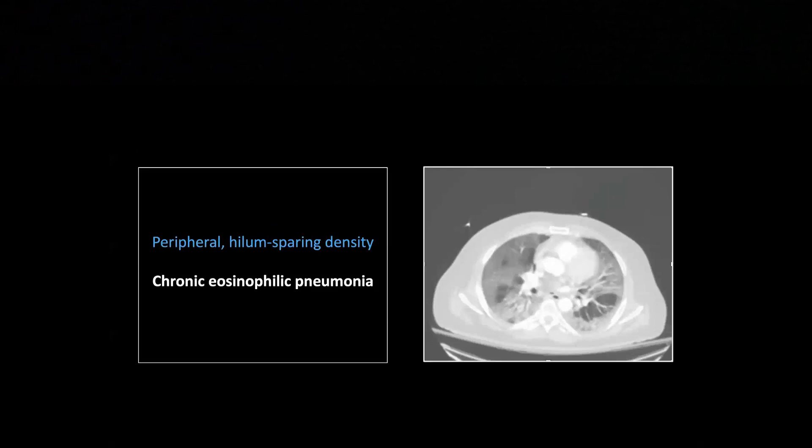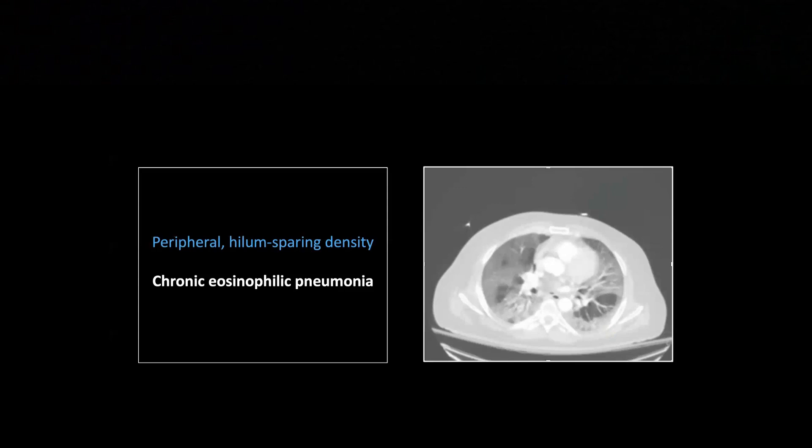A little less common. This one is what they call reverse pulmonary edema. It's the exact opposite of what we were just looking at. It's peripheral and it spares the central portions of the various lung lobes. This is unfortunately one that's also nonspecific. You look up reverse pulmonary edema and you'll get a whole big list. But the classic is eosinophilic pneumonia that causes this peripheral ground glass density or even consolidation.